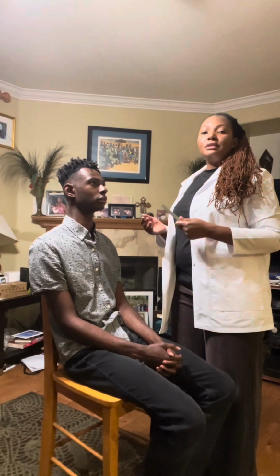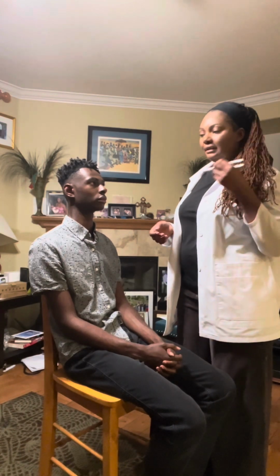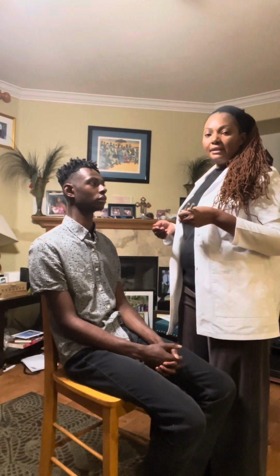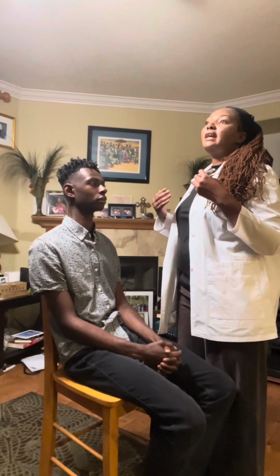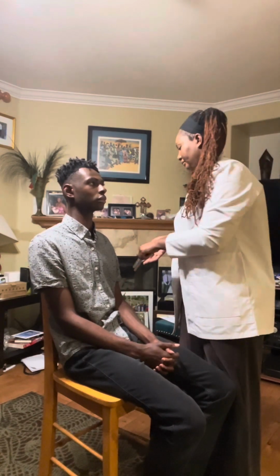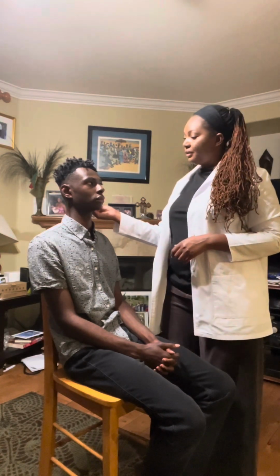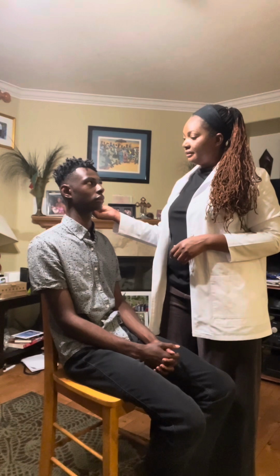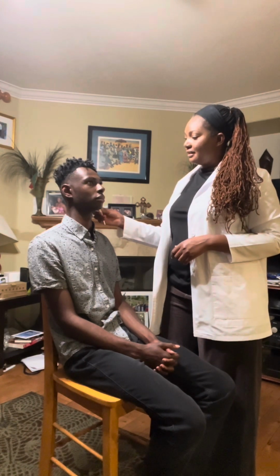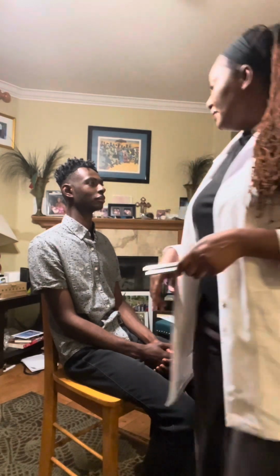And I'm going to do the Rinne test, and I'll put it at the back of the patient's ear and ask the patient to let me know if they can no longer hear. I can no longer hear it. Okay, now can you hear? Yes.